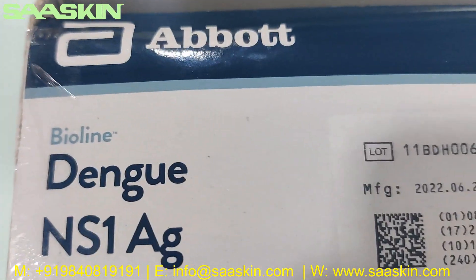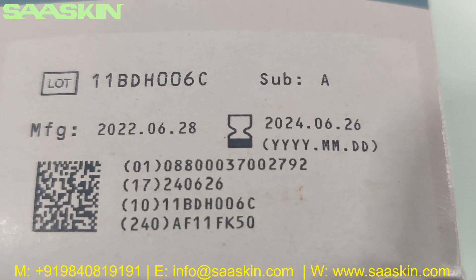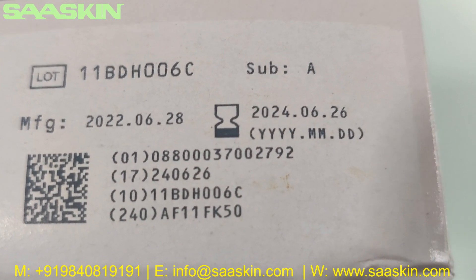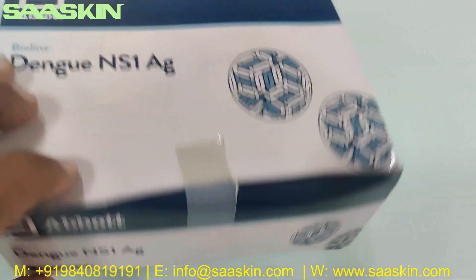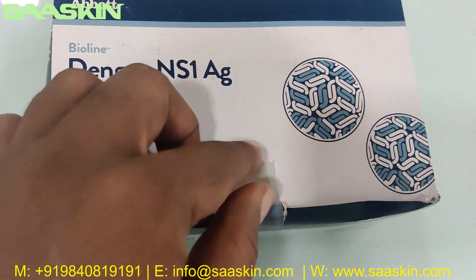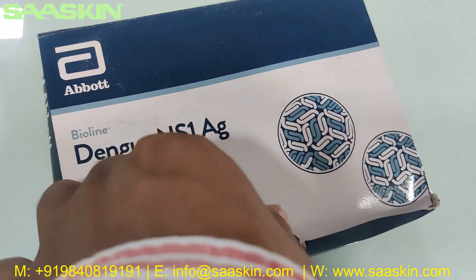It says Abbott Bioline Dengue NS1 Ag on the standard. You have a 2-year expiry period. I am going to unbox and show the contents inside for you.